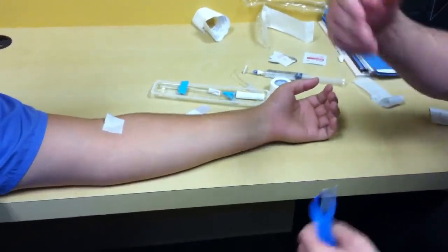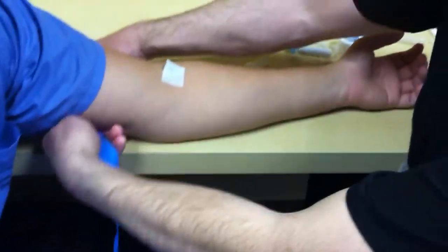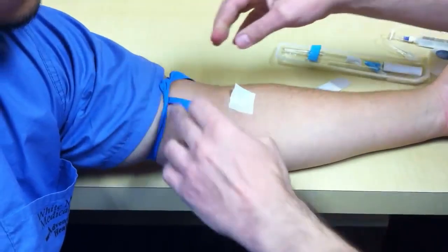If I was afraid that there was going to be a lot of blood, I would be wearing gloves, but because we're not contacting any blood, there's no need — in my opinion. You're going to get different opinions everywhere you go. This is only my opinion.